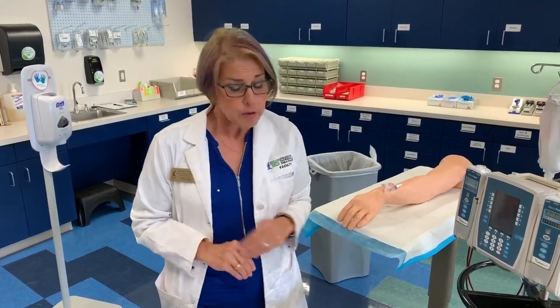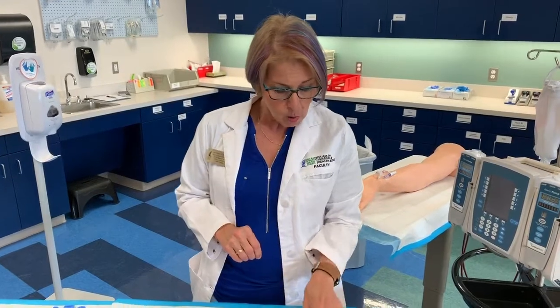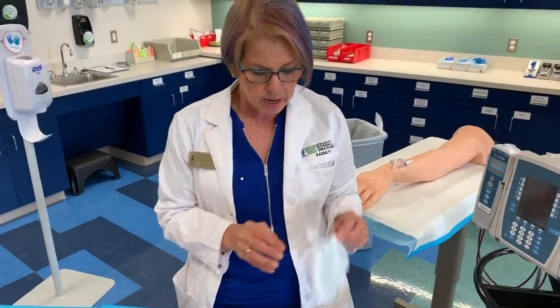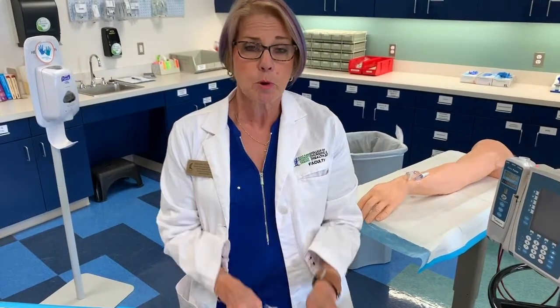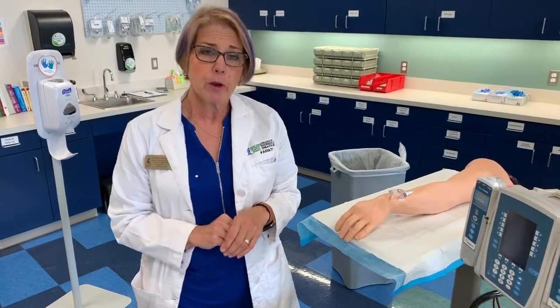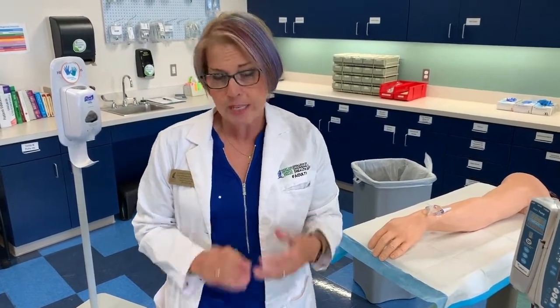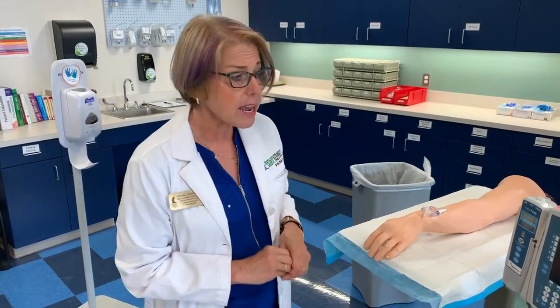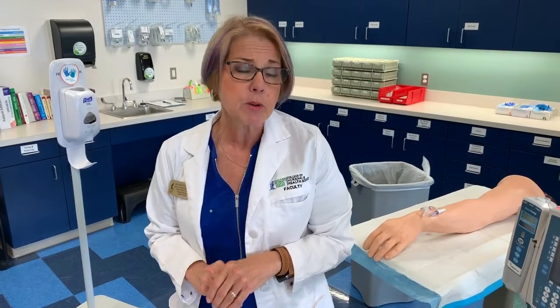Now, there's two ways we can hang IV fluids. One, we can use a gravity set, which is just an IV administration set, or we can use our pump. So we're going to go through and look at both of those. So first thing you want to do is review your healthcare provider's orders to determine what type of fluid, how much volume, the flow rate, and how long that's going to institute. So today we have orders to begin a normal saline drip on our patient running at 100 milliliters an hour.